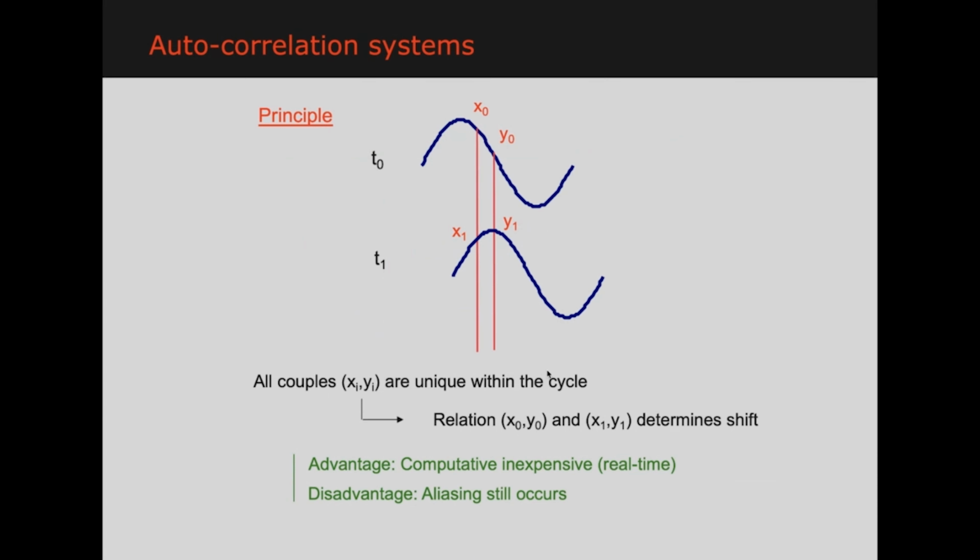Now, in order to calculate this very efficiently, what you can prove is that by using autocorrelation, we're not going to go into mathematics, but what you do is you take the pulse from one reflection, you take the pulse of the next reflection, you take 2 points, and you put this in a correlation formula, you can calculate the velocity. And so autocorrelators are very typical equipment used for Doppler imaging. You don't need to go into details, but you just need to know that with only very few pulses and the right processing, we can also do a velocity estimate.